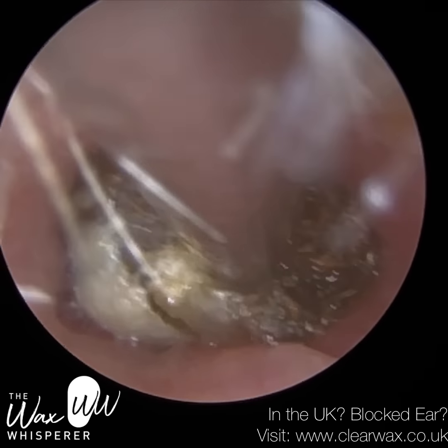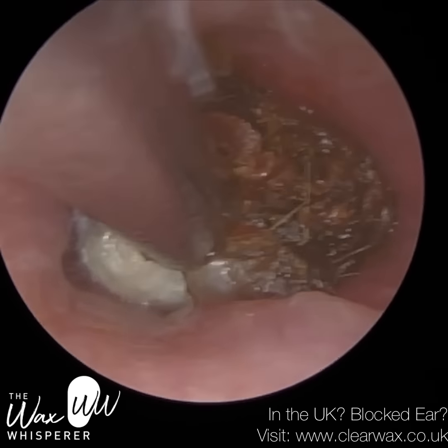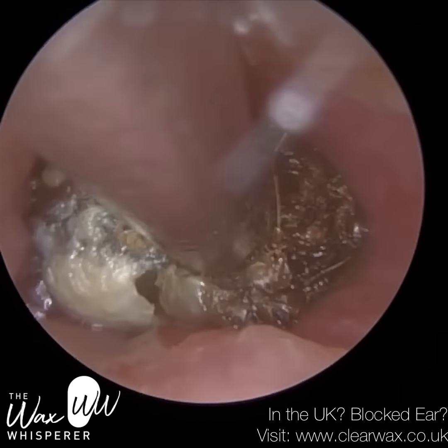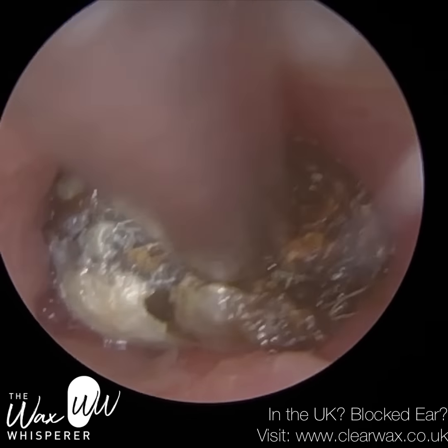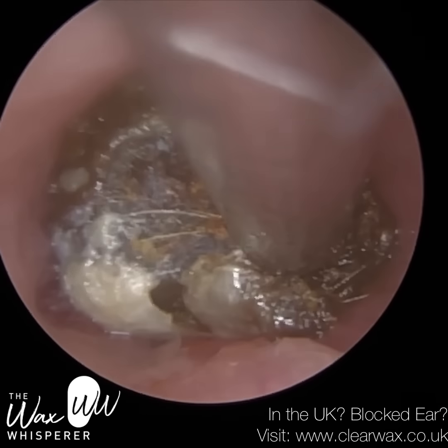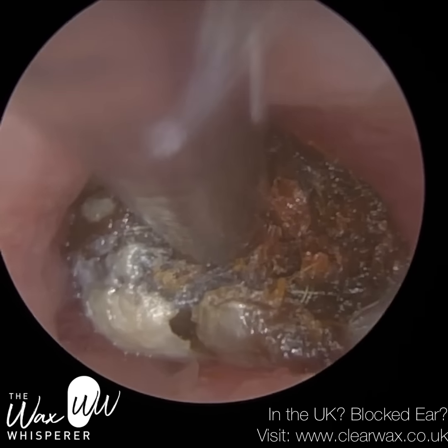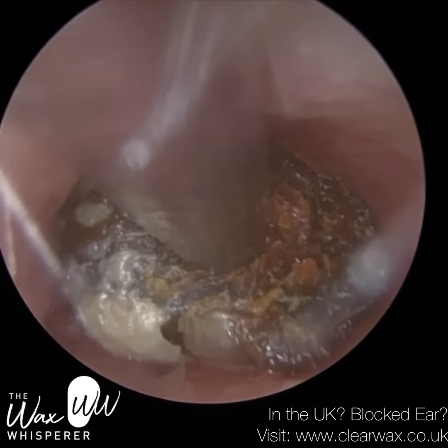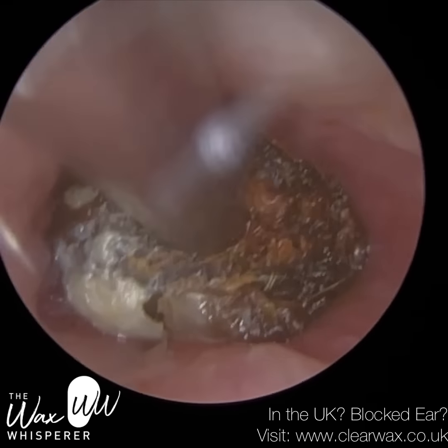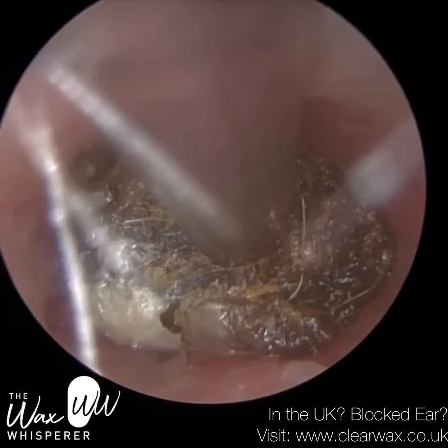So it may be frustrating to watch, but I was enthralled by the procedure. I've not done Keratosis Obturans in a while, actually. I went through a phase where I was doing at least 2 a week, and then it simmered down, and I had this one today. And the reason why I like doing it is a real challenge, because I'm trying to remove it whilst making sure it's comfortable as possible for the patient. So we are slowly but surely getting there.